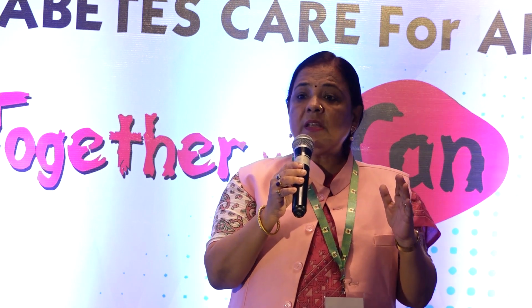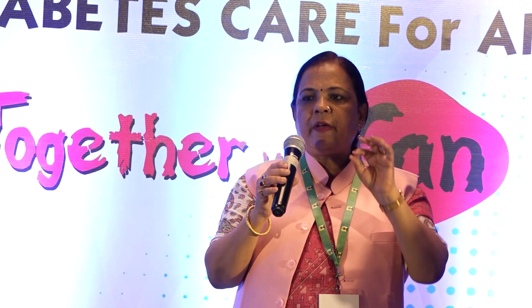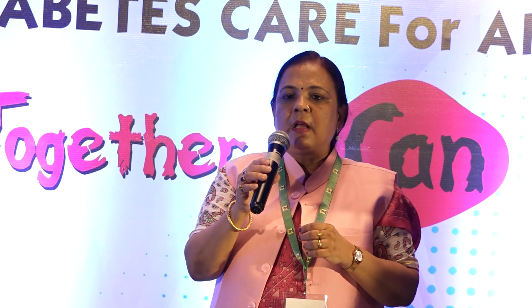So first, get a look at the device. Many of you are using it. So the commonest which we use is the Freestyle Libre. This is there, and Dr. Guru Prasad Bhattacharya will demonstrate in detail how it is to be applied. I have been using it for the last 7 years, since its inception. We have also got the Libre Pro, which is a professional variety where the sensor has to be applied with an applicator. Basically, I would explain the sensor.